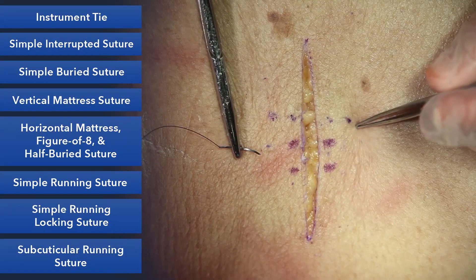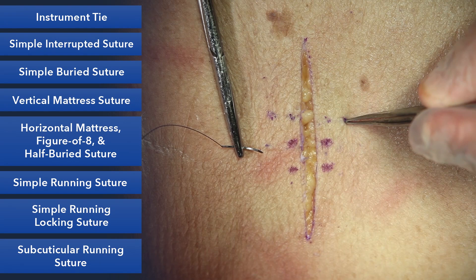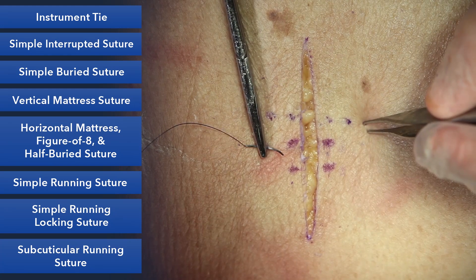Our next suture is the horizontal mattress suture. Its configuration is horizontal as opposed to our vertical mattress. You can think of this as two simple sutures — in some sense, it's a simple suture that just saves you some time.